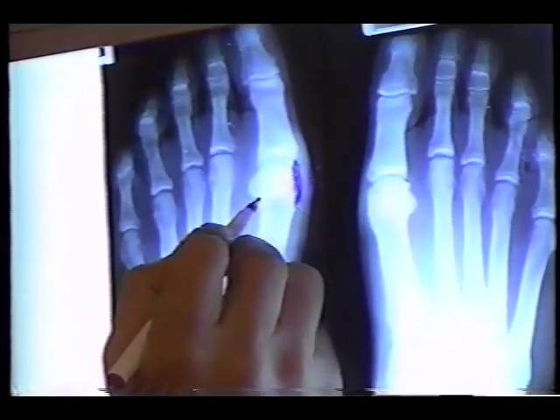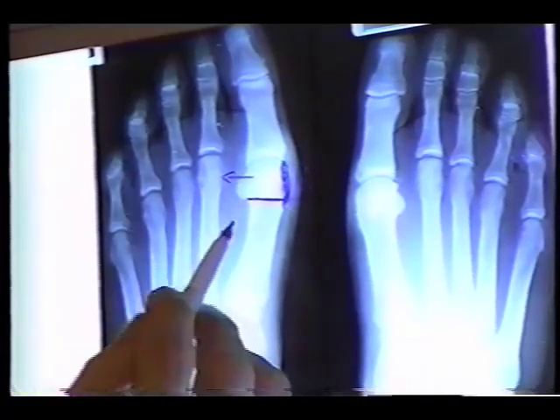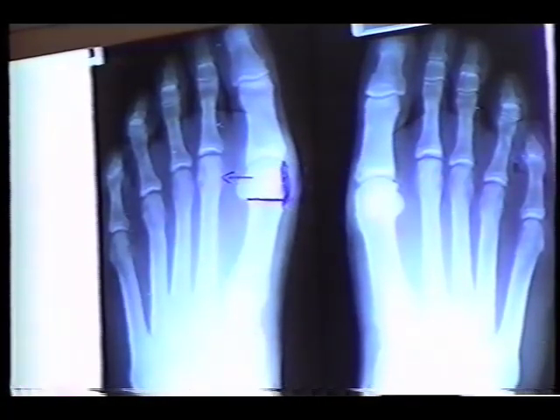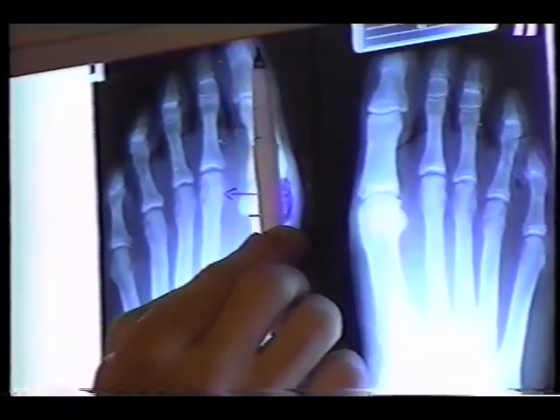First, we're going to cut the bone right about here. I'm going to cut the bone, and I'm going to slide it over like that. Once I slide that bone over, I'm going to slide it on top of these two little bones so it's sitting dead center over the top of those two little sesamoid bones. Now when I do that, what that's going to do is it's going to take this crooked toe and make it straight.